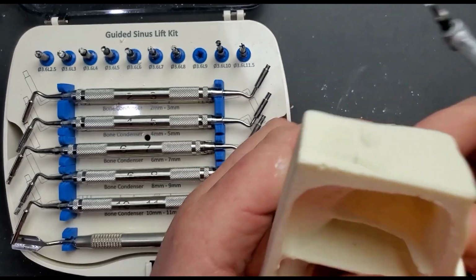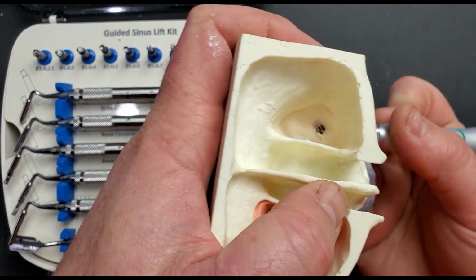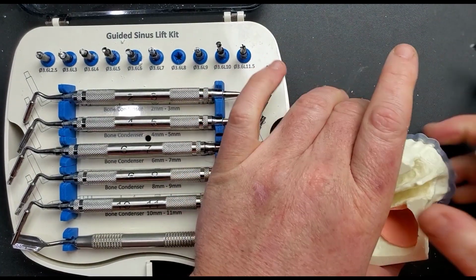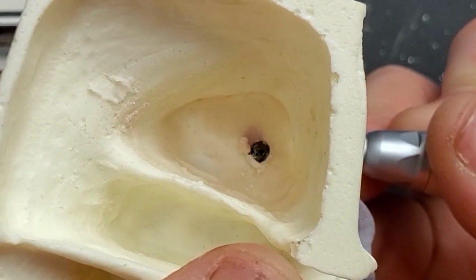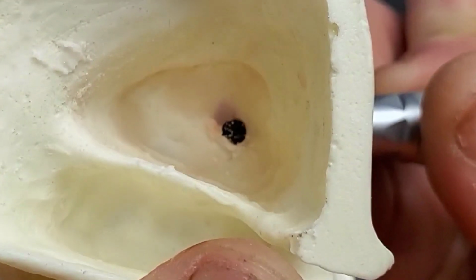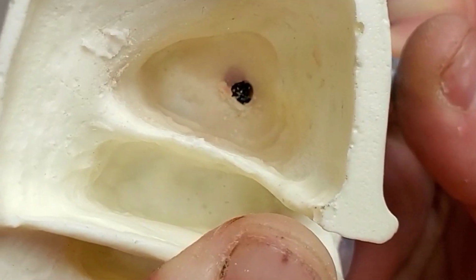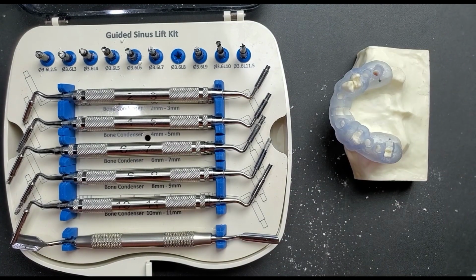Now just to show you on the opposing side what this looks like, I'll introduce this into the site. That one is a little bit long, as you see, so let me just grab a different drill so that you can see how this looks without the membrane in place. Okay, so you see that one just gets through the sinus floor without going too far. So that's about where you would break through the sinus floor, and again, just pushing up on that 1mm is not going to do any significant damage to the membrane. So we've gone through the sinus floor.